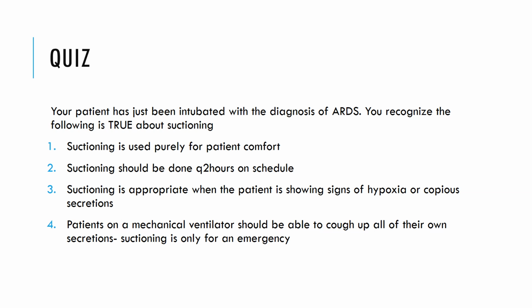So let's take a quiz. Your patient has just been intubated with the diagnosis of ARDS. You recognize the following is true about suctioning. 1, suctioning is used purely for patient comfort. 2, suctioning should be done Q2 hours on schedule. 3, suctioning is appropriate when the patient is showing signs of hypoxia or copious secretions. And 4, patients on a mechanical ventilator should be able to cough up all of their own secretions. Suctioning is only for an emergency. Pause the presentation and consider your answer.